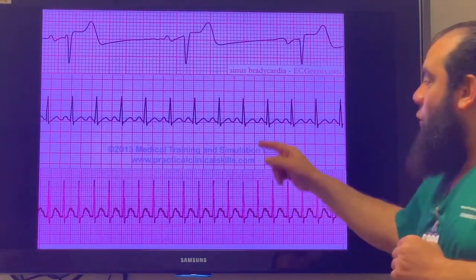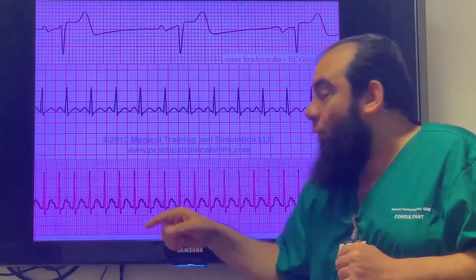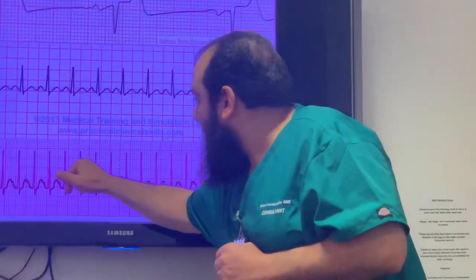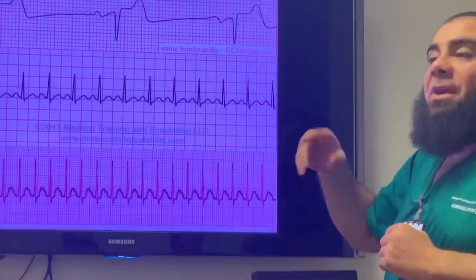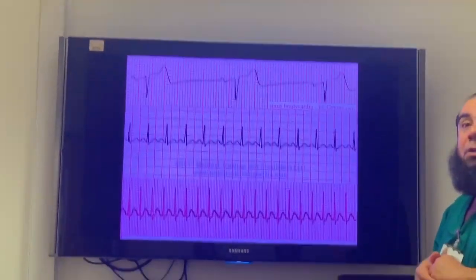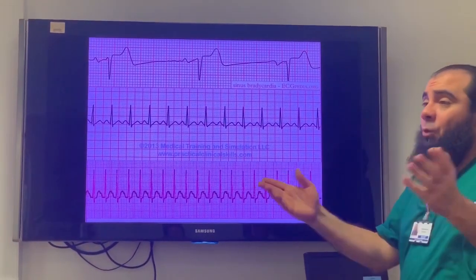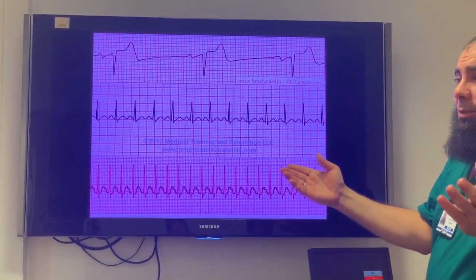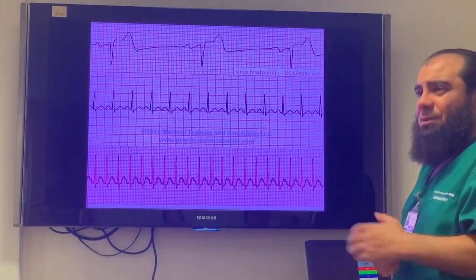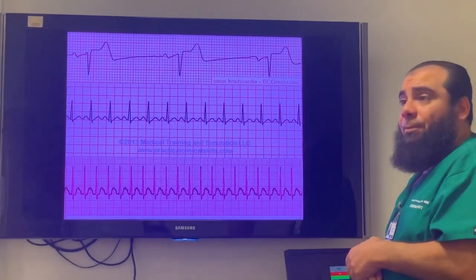So 1500 by 7 or 8, it will come approximately near 200, isn't it? 200 by 7 anyway is 1400. So it's 214 approximately. Okay.